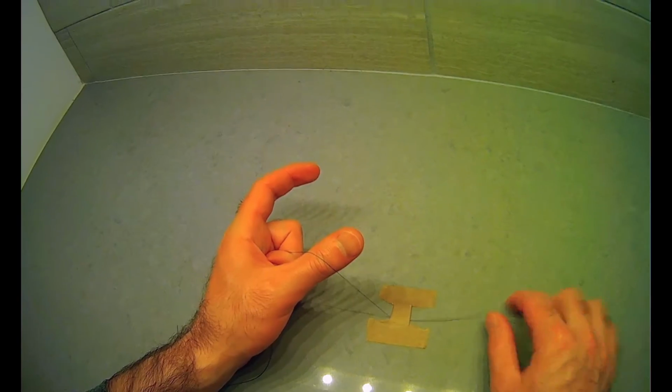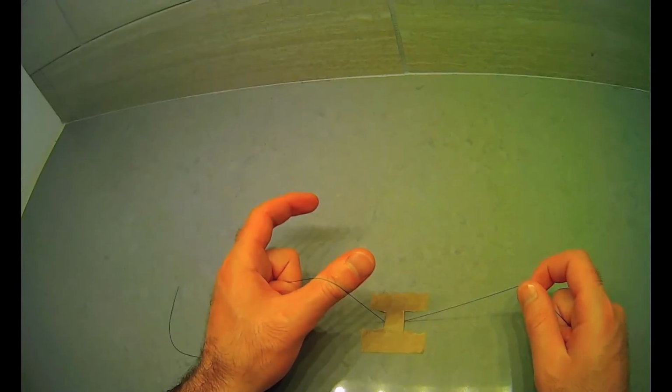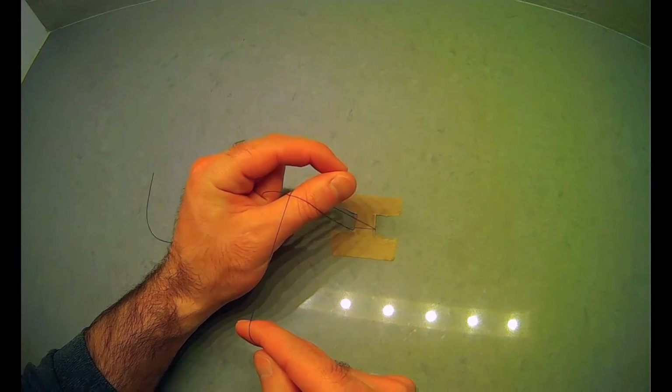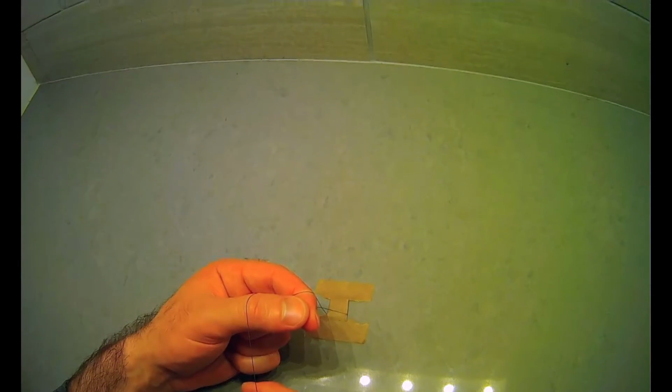So to start, this is how we hold the suture. And we can see that it's coming over the thumb and through the palm of the hand off to the side over here. And again, if you don't get this orientation, everything's going to be very, very difficult. But just make sure that you are oriented properly, and then everything else will fall into place. So we have our suture here coming over our thumb. Now the next step is to literally encircle our thumb with suture. So all we did is, because the suture is coming like this, we have to bring the other one around the thumb here and literally make a loop. The next step is to pinch our fingers together and then pull our index finger through the loop that we created around our thumb.